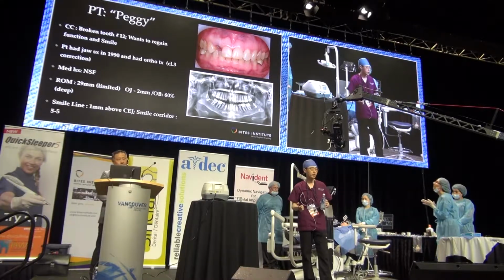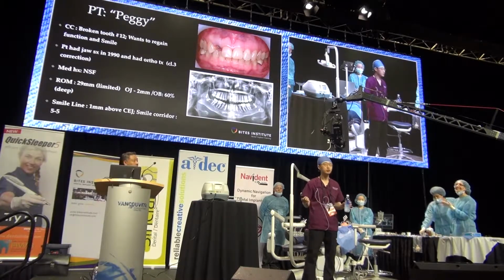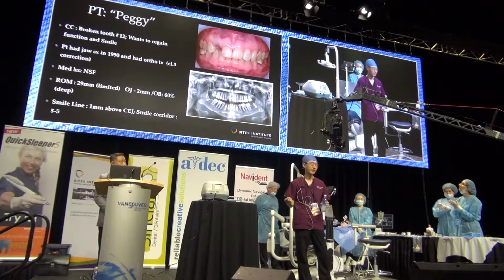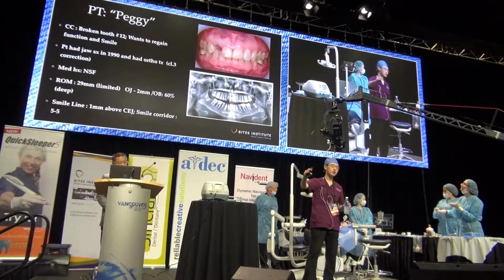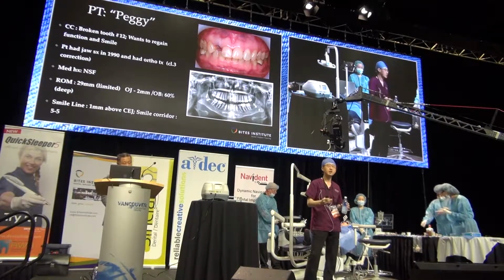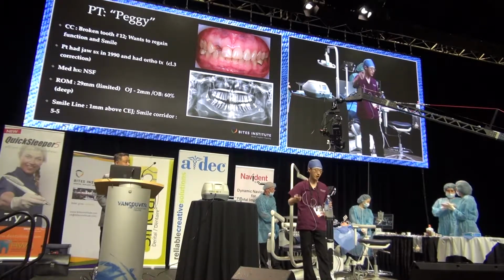Whenever we do an anterior case, another important thing is smile line. I jokingly say, on your first anterior case, do not work on a patient who's a female with a high smile line, because those are the challenges. There is implant dentistry and there's aesthetic implant dentistry. It's a different level. With front teeth, patients come not for an implant, but they come for a smile. Would you agree with that, Dr. Lin? So that puts us at a different challenging level.